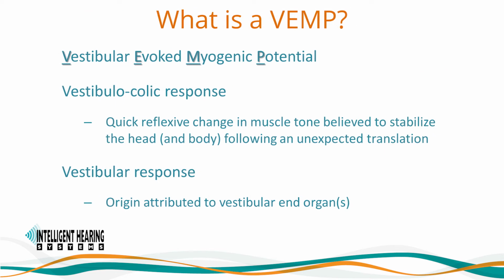What is a vestibular evoked myogenic potential? The vestibulocollic responses are quick reflexive changes in muscle tone believed to stabilize the head and by default the body following an unexpected translation.